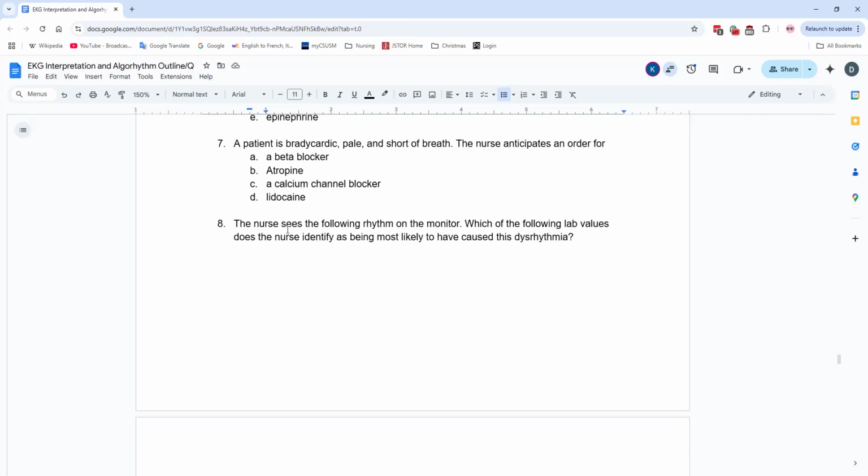Cool beans. Number 7, patient's bradycardic, pale, short of breath. The nurse anticipates an order for what?